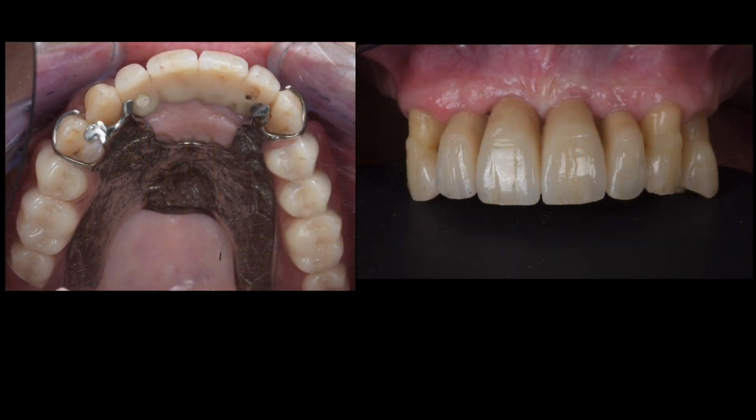And he has his removable partial denture in the posterior. Nothing sexy here. This is why we wanted to show you this kind of daily patient. This is real life. Real life, and we keep the hooks. Why? Because he's old and it has to be easy for him to take out and put in. Nothing very complicated, make it simple. The patient asked, please make it simple. I think it was quite simple.